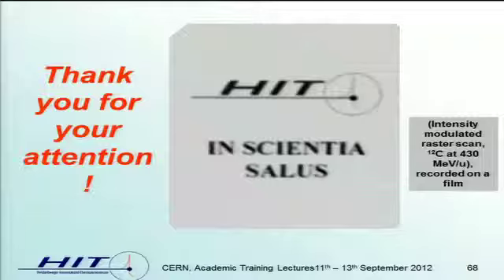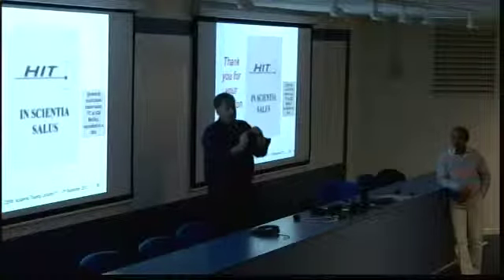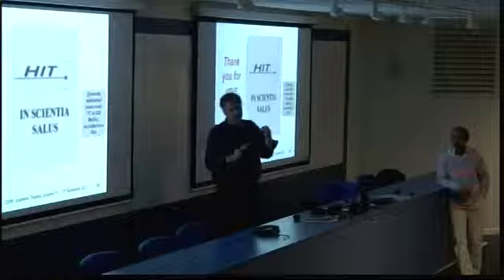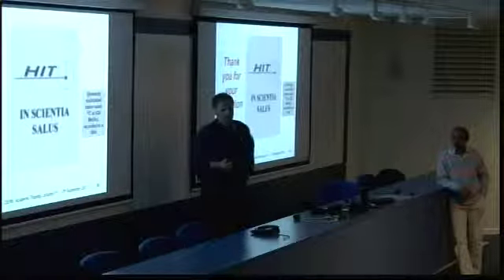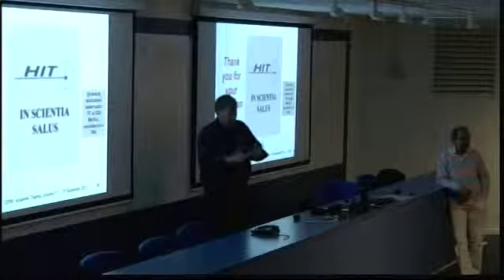I have a question about the rotating gantry. Do you need to set the beam angle very precisely, or could you imagine working with a number of fixed beam lines at different angles? This is always a good question, but think back to the example I showed you, where we have a very short, very small entrance channel for the beam to a pancreas tumor, for instance. There's no chance to have then 3 rooms with 30, 60, and 90 degrees.